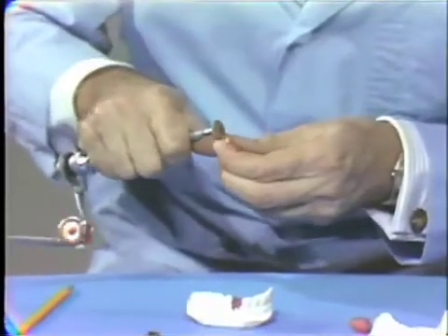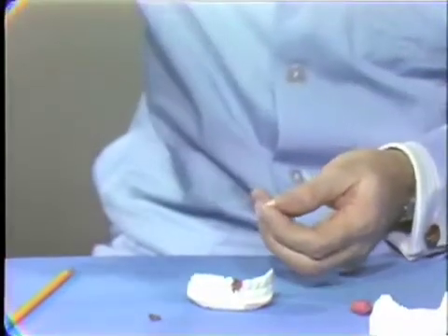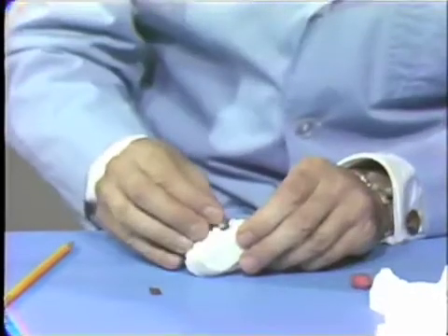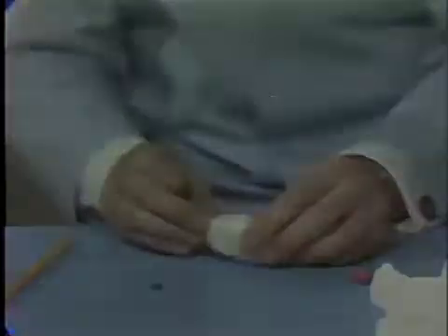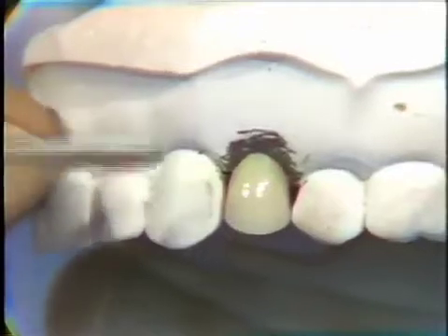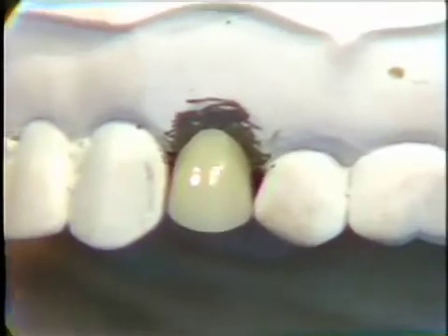So this is a grinding in procedure with which I think you're familiar, and I'm not going to go right through the whole procedure. We'll pick it up a little bit later on when we've completed the adaptation of the cervical part of the facing to the model. The Trupontic facing is now being ground and adapted to the mucosal tissue and corrected for vertical length. And I think as you see the model now, you can see that we've got a reasonable adaptation of the pontic to the gingival area here, and that we've got about the correct vertical length.